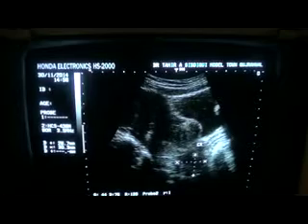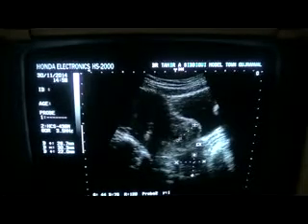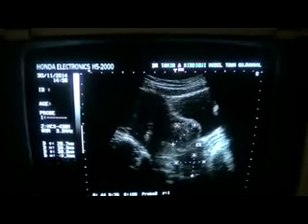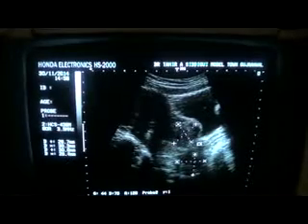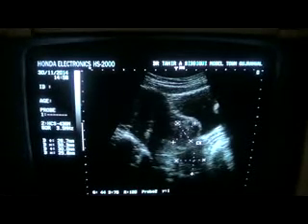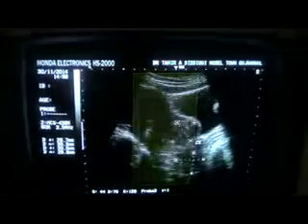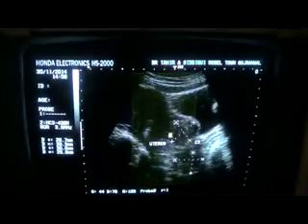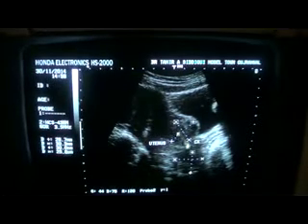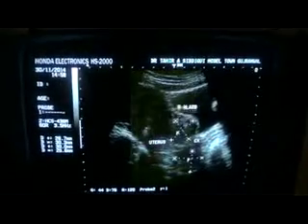This is the urinary bladder, and you can see this is the indent that this solid echogenic area makes, which is a subserosal posterior segment of the anterior wall fibroid. So in this section, clearly seen is that there are two fibroids. This is the area of the uterus, myometrium, and this is the fibroid. F will denote the fibroid. This is the cervical fibroid, and this is the urinary bladder, this area.